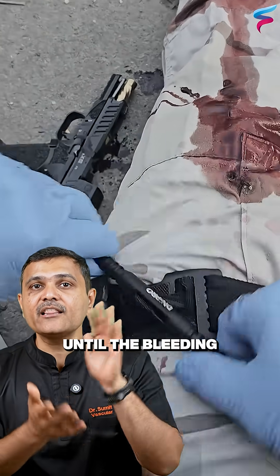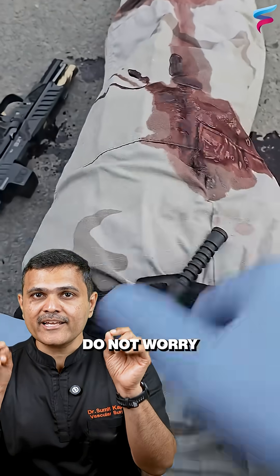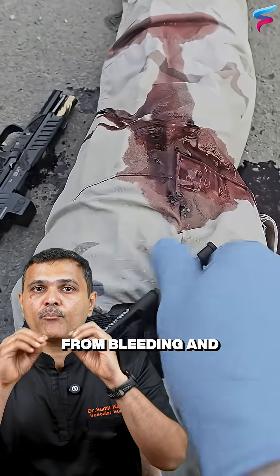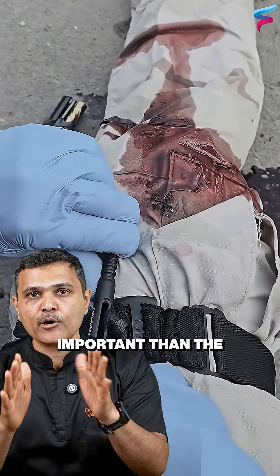Tighten the tourniquet until the bleeding stops. Do not worry about the patient complaining of pain — saving the person from bleeding and dying is more important than the pain.